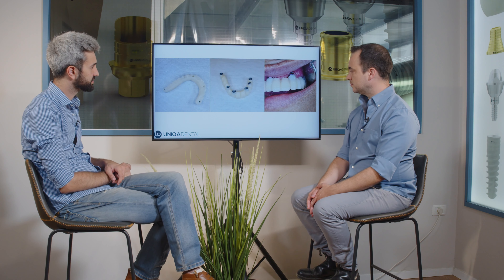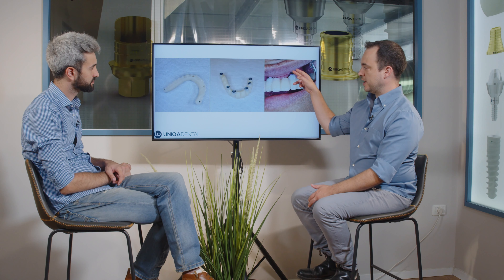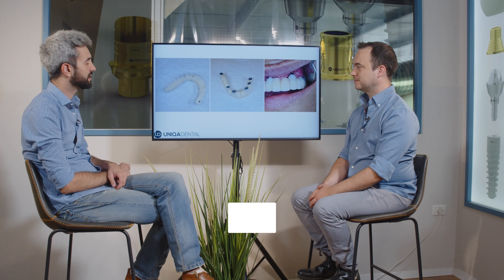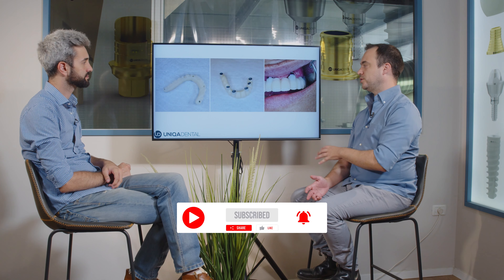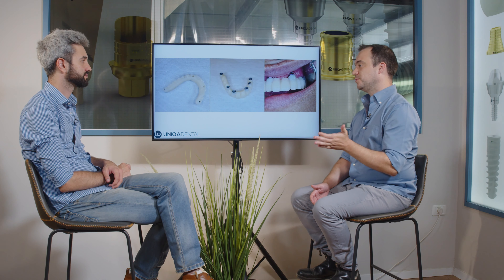This is the temporary restoration — the second bridge. This is the second temporary restoration and the design is much better. As you can see, this multi-unit was changed because the screw channel wasn't in place. The teeth got a little bit whiter. This is the temporary restoration. Right now we're going to take a break from the upper jaw and take an impression from the lower jaw, which also had implants. The patient wished to change the crowns on those implants, so now we are focusing on the lower jaw.